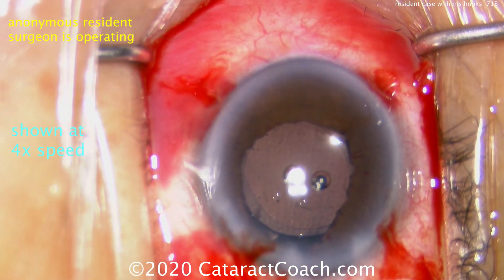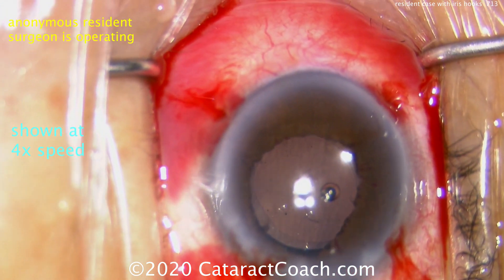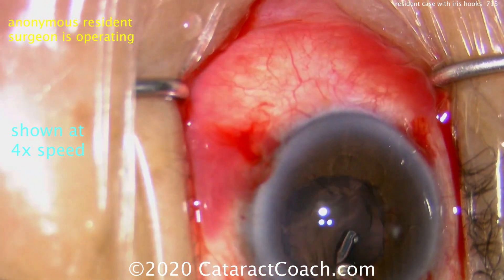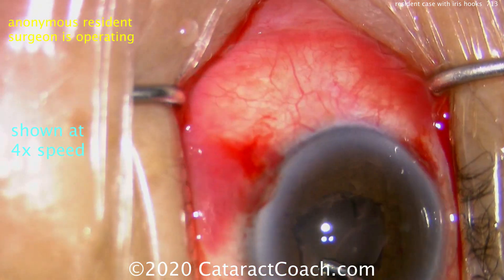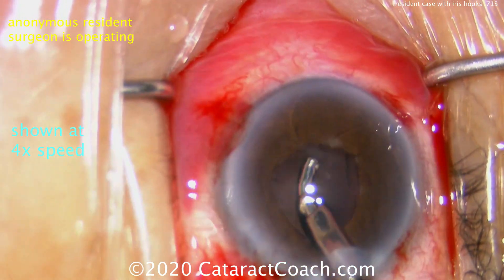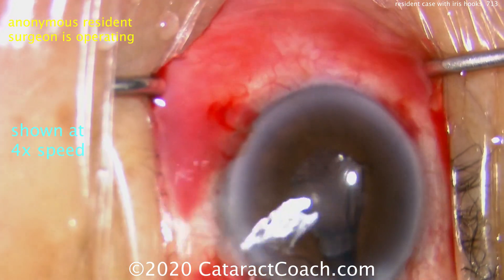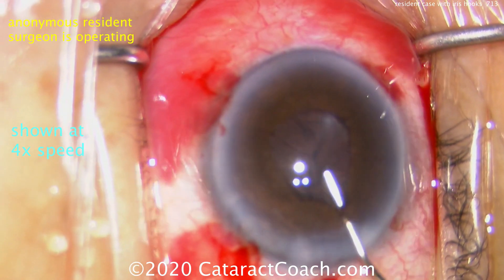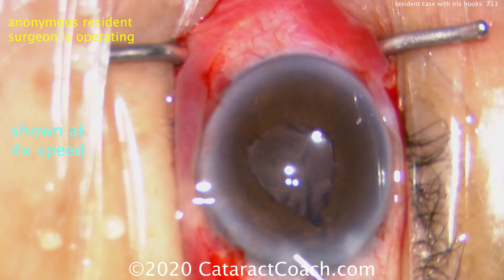Time to remove the viscoelastic — this is a great case. One more point: let's make sure you don't have any leakage. Remember, you've got your main phaco incision, plus your paracentesis incision, plus in this case five more small incisions to place the iris hooks. So you need to check all of them and make sure they're all watertight — that's seven incisions to check. Five of them are very tiny, less than a millimeter, but let's make sure we check all of them.